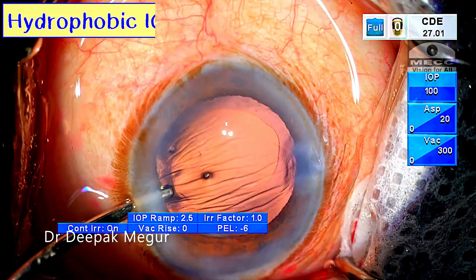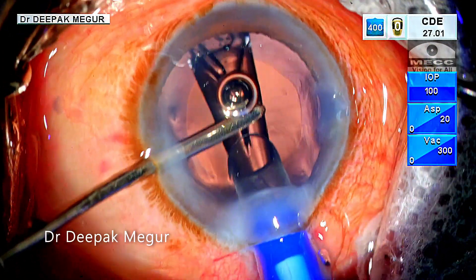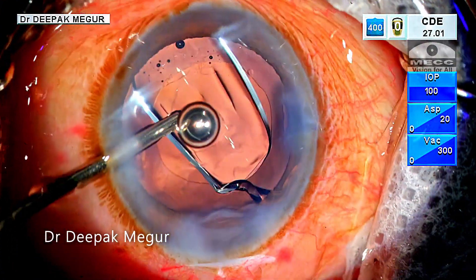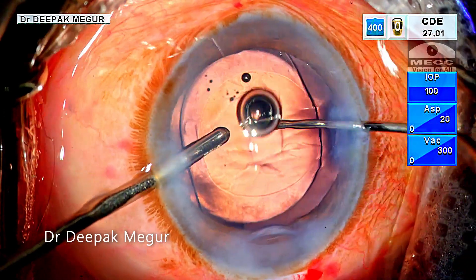A few more cases. The key to remember is that the chamber and the capsular bag have to be well formed at all times. While implanting the lens, distortion of the wound should be avoided, as this would compromise the depth and stability of the anterior chamber and the capsular bag.